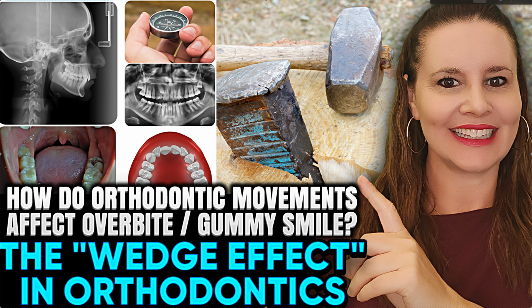Now you can read through those articles I talked about, and mostly in a nutshell, if you move things more forward, like if you're gonna take crowding and expand and move things forward, you're gonna find a bite opens up. That means that the bite, if there's a deep bite, that might be positive, right? Usually in these situations, your incisors are pretty upright anyways, kind of like this incisor is upright, right? But this one is about normal.